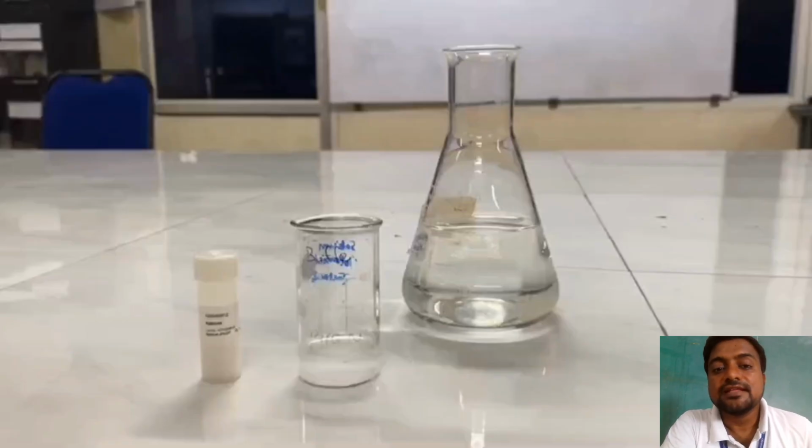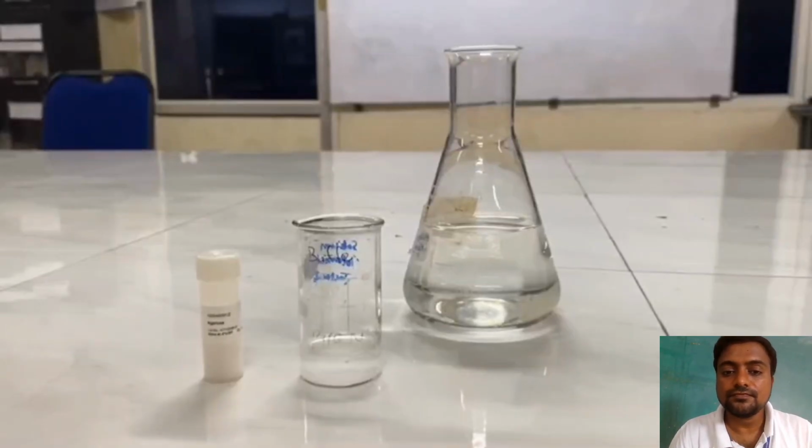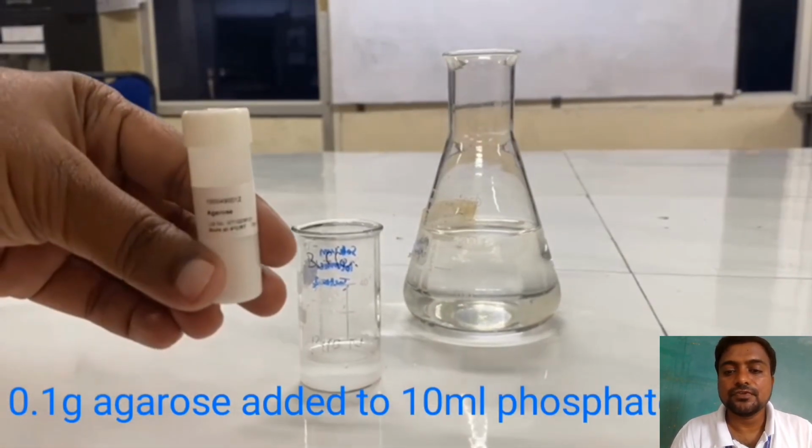So the diameter of the precipitation ring is directly proportional to the concentration of the antigen present in our test sample. We will make use of standards A, B, C, D, plot a graph, and from that determine the concentration of the antigen, that is T1 and T2.